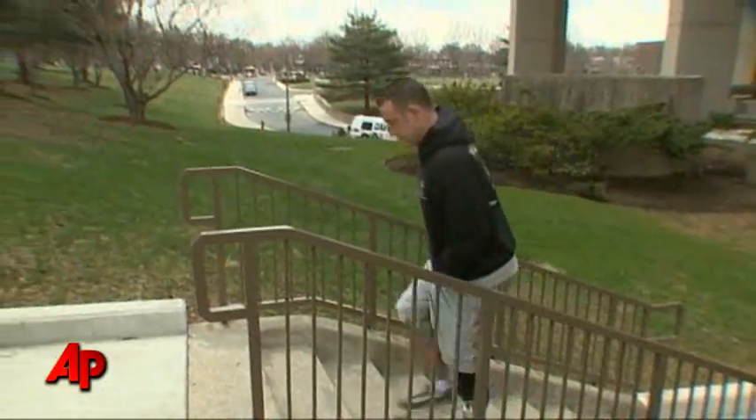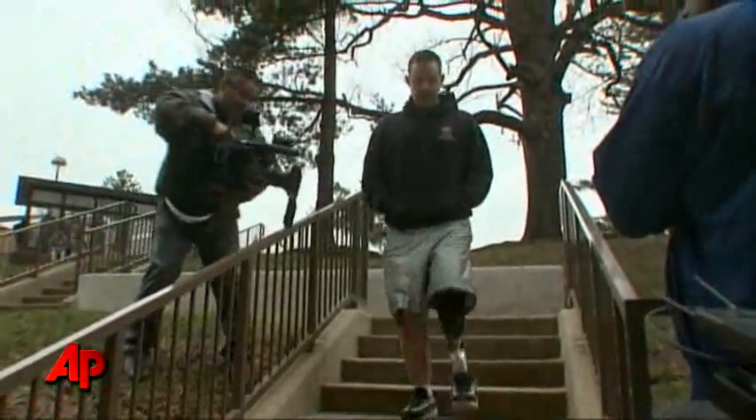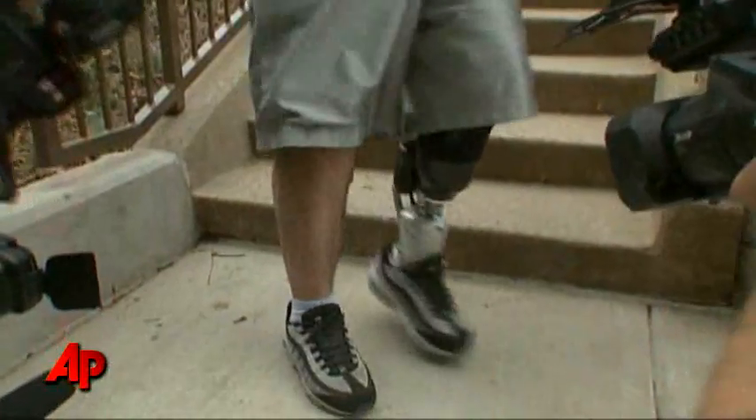There's no question that with the current prostheses available on the market, individuals can walk, can go upstairs, can do pretty much everything — even run marathons. But the difference is all of those devices are passive devices, meaning that the individual has to propel them themselves. They have to use more proximal muscles, muscles above the knee for example, to make that prosthesis work.